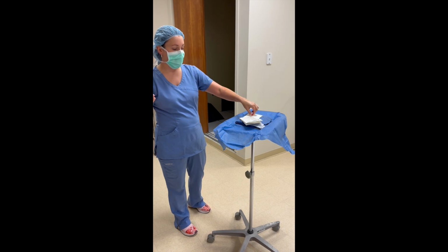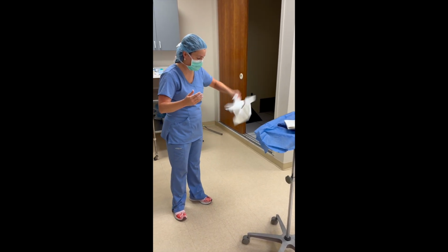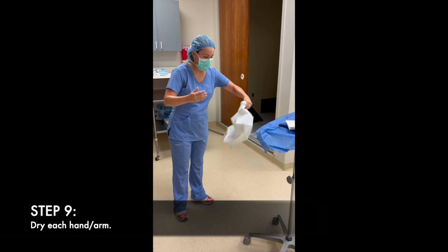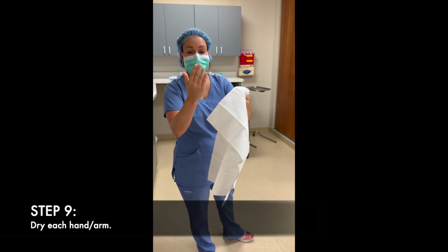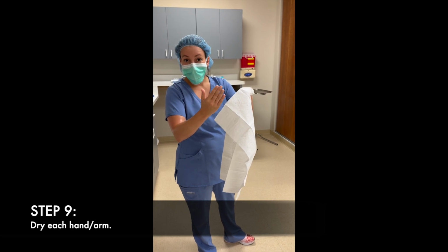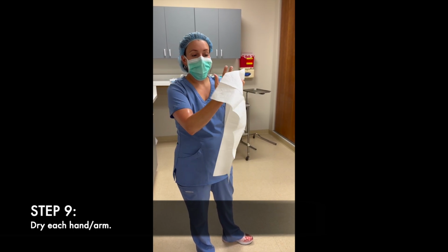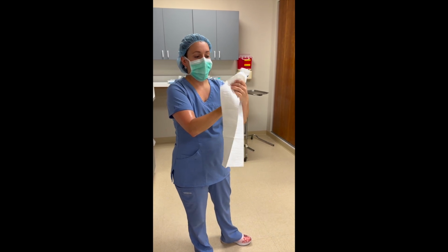I'm going to grab this towel, and yes, I'm going to shake it out, because if I don't, it's not going to shake itself out for me. You're going to start by drying your fingertips and each side of your finger once. The goal is to use different areas of the towel as you get it wet, right? So I'm going to start here. I'm going to pat. I'm never going to rub. Don't rub, okay? I'm going to pat.